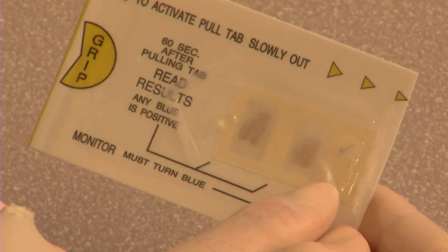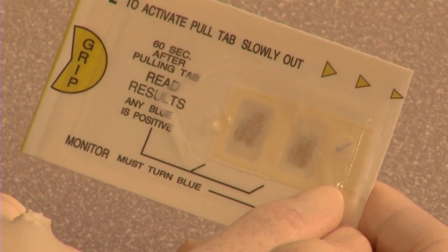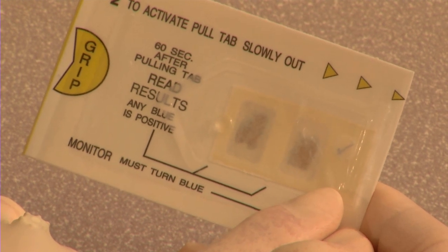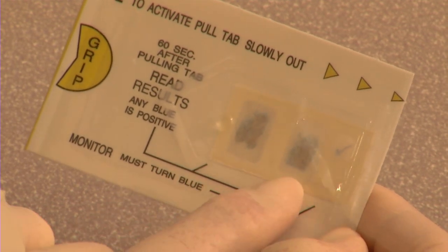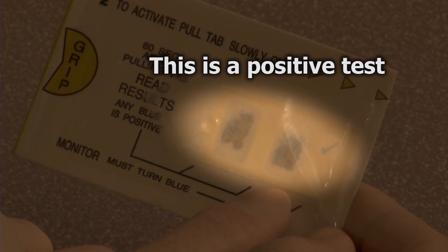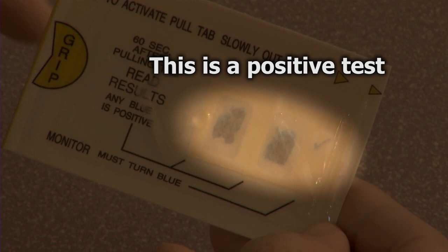On the right side of the card are the internal controls. The positive control is a blue check mark. The negative control is the background behind the blue check mark, and the color should remain unchanged. If you don't see the blue check mark, it's not a valid test. Patient results are interpreted from the two sample windows. Any blue in either or both of the windows is a positive result. No blue is a negative result.